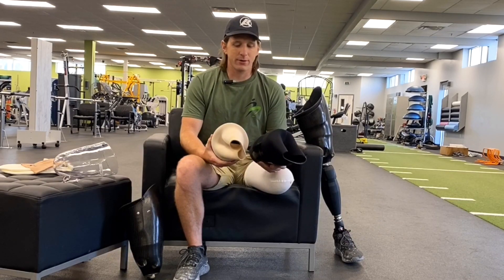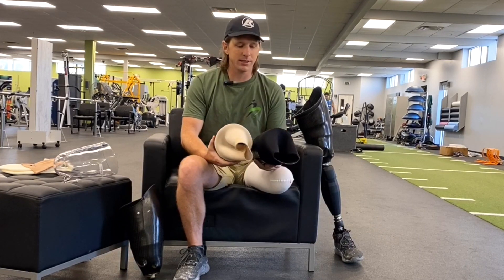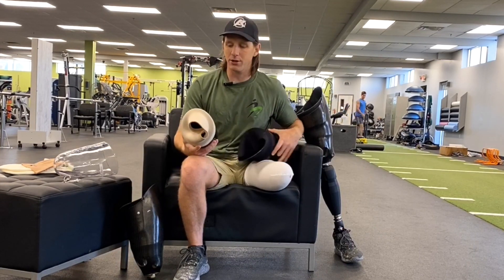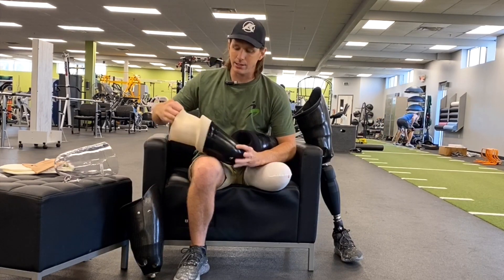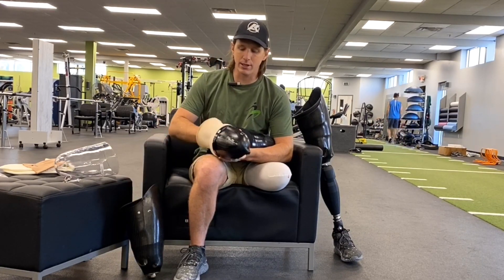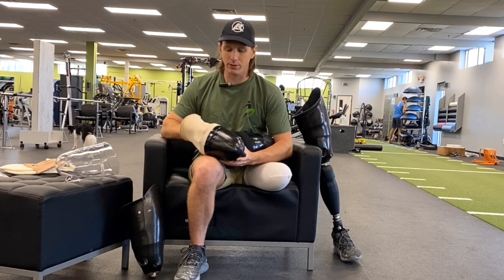I've been in the double wall socket for almost five years now and I really love this socket for multiple reasons. I feel like it's really secure on my limb, almost part of my leg. It's really comfortable — I'm standing for 10 to 12 hours a day and it just really allows me to do whatever I want to do in life.